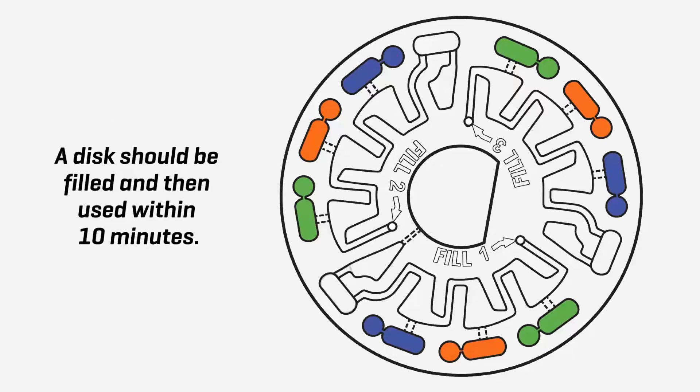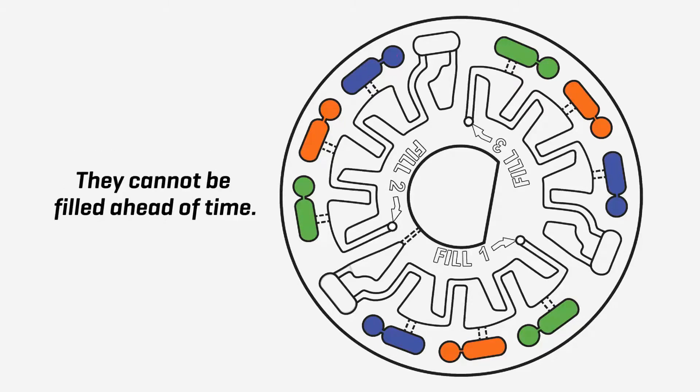A disc should be filled and then used within 10 minutes. They cannot be filled ahead of time.